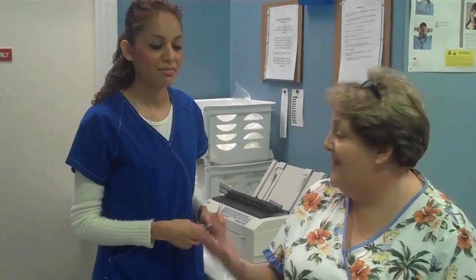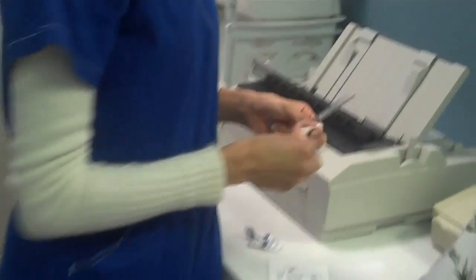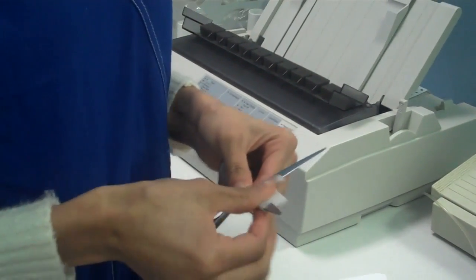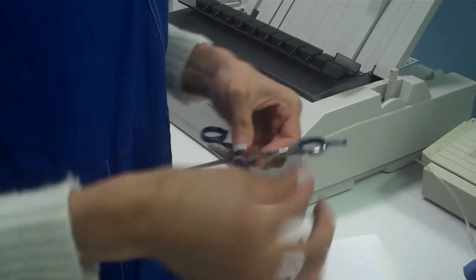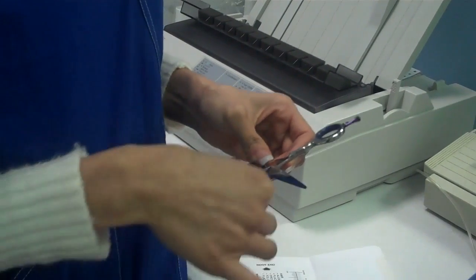Don't cut it. After you've washed your hands and explained the procedure to everyone — and we explain it to everyone, no matter if they're here for the third or fourth time, we still run through the procedure with them. Next, we're going to clean the scissors and let the client see you clean the scissors so that they know they are clean prior to using them. Clean the outside and inside of the blades. We use alcohol swabs here.